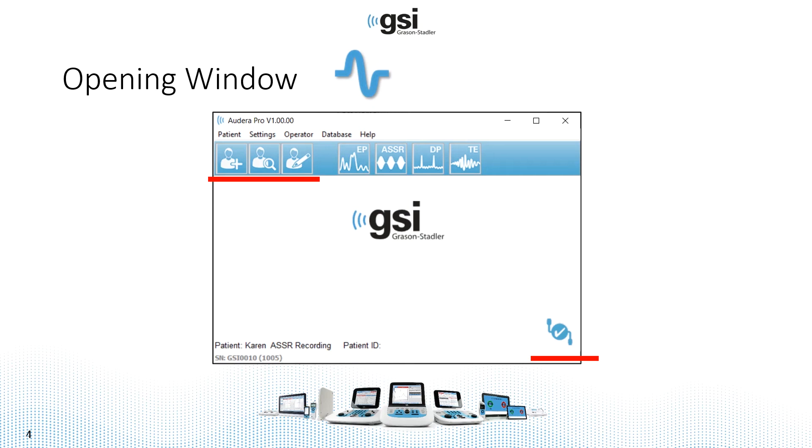say ASSR and OAE, you would only have to enter the patient information one time, and then you can navigate between the different modules, and all that test data will be saved under that patient.